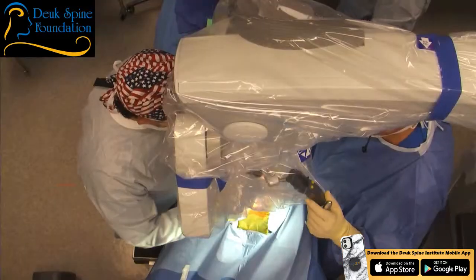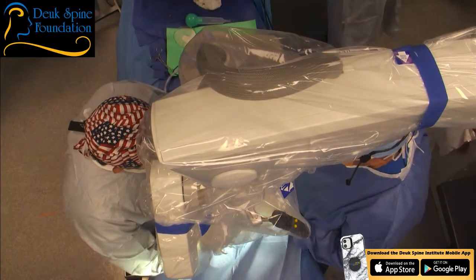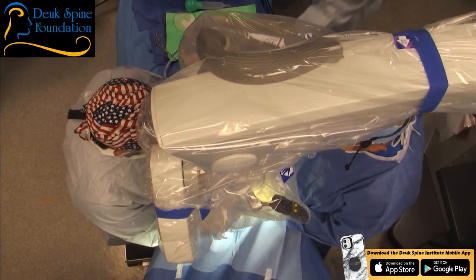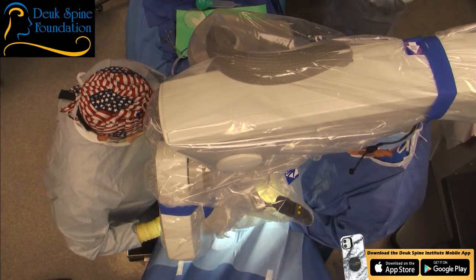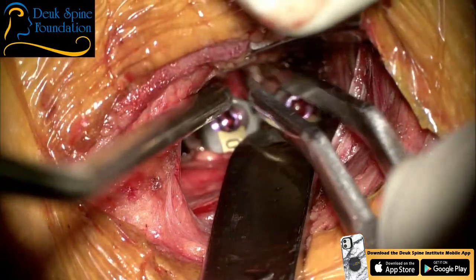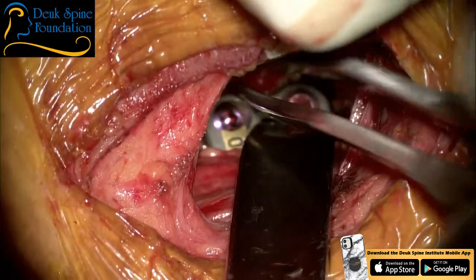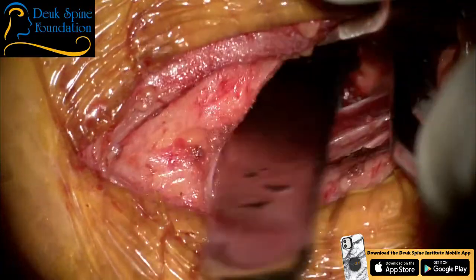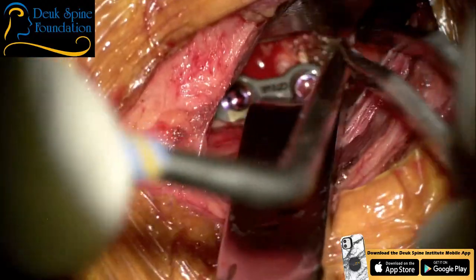Watch your eyes. I'm going to angle south. See how nice hemostasis at the end of the case? Okay. Wipe, please. Pull this back. Not the toe, but the knee. There you go. I need gel foam and thrombin. I'm going to sneak that back in the corner there. Good job. All right, let's see. Now we just need down here. I just need you to pull that knee back so I can see.